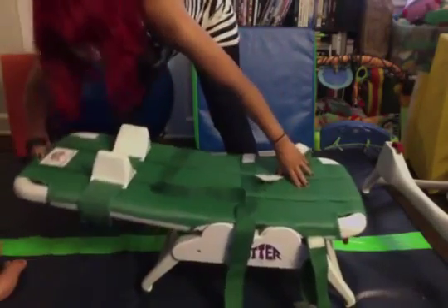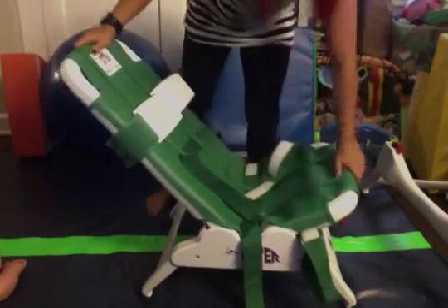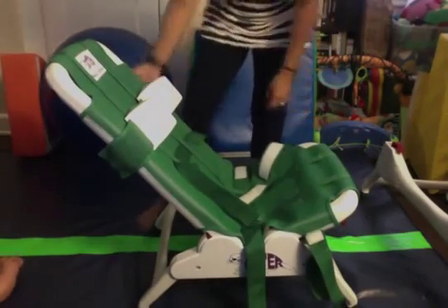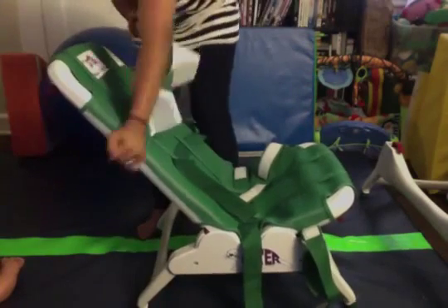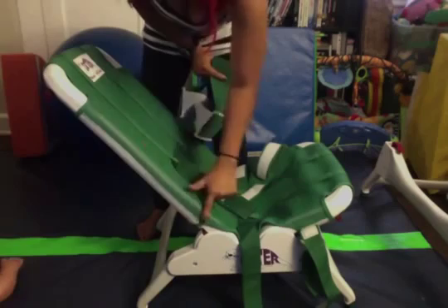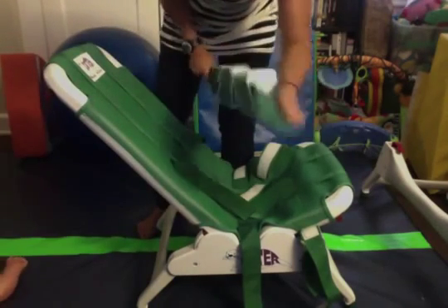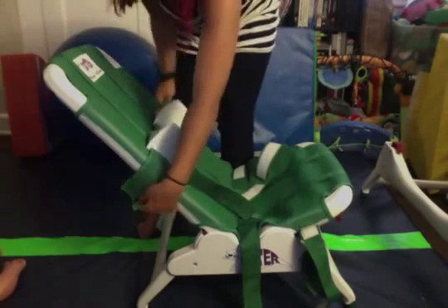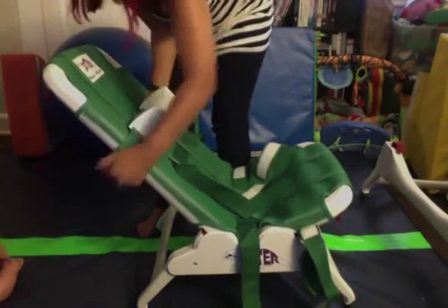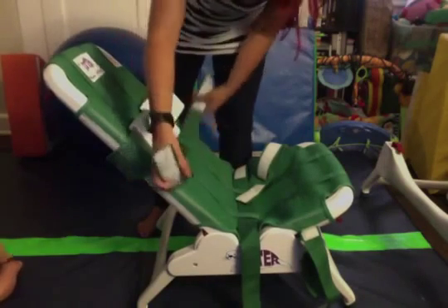Parker likes it at about this angle. On the side here it's lined with velcro so you can adjust the headrest to whatever height you'd like. He needs it about right here, so we usually stick it right there.